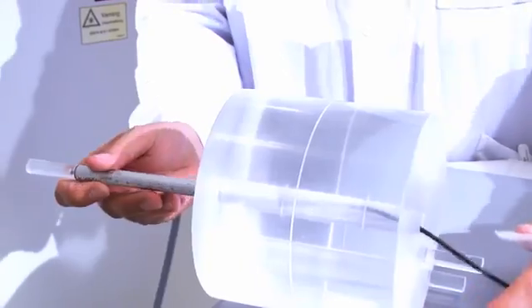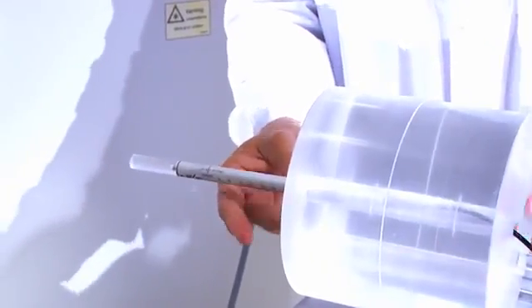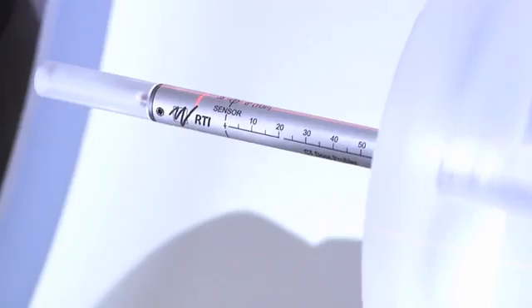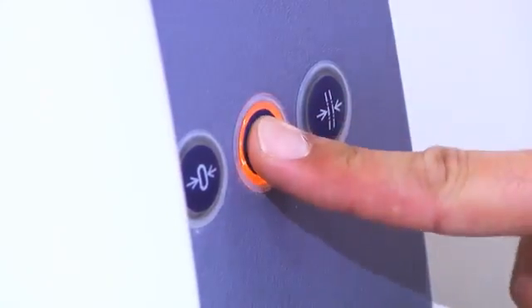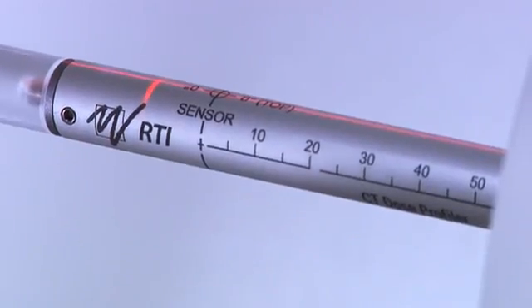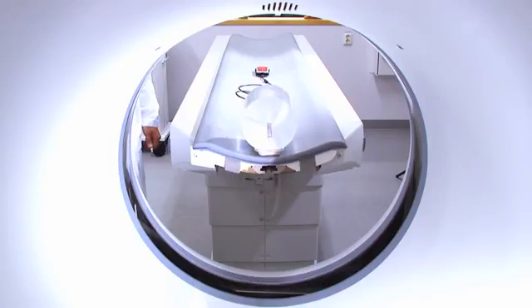First, you have to put the CT dose profile detector into the correct position. A tip is to use the phantom you just used as a stand. Align the detector with the lasers. Perform a new scout.